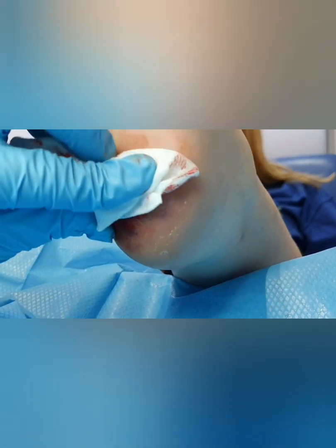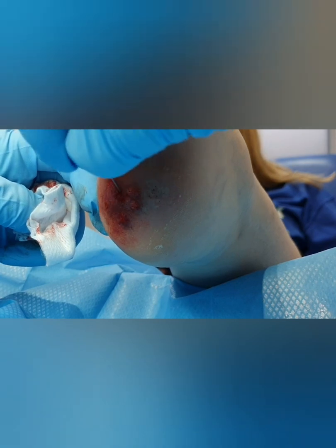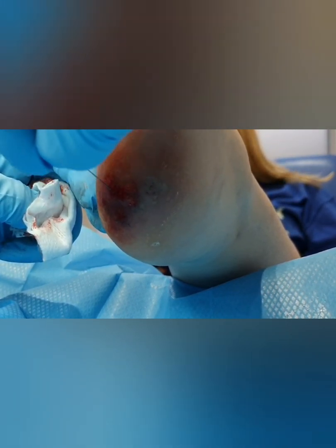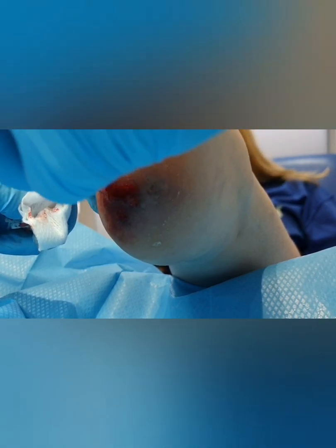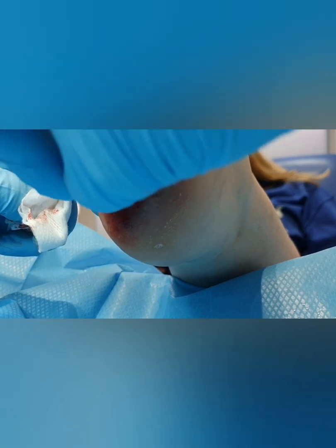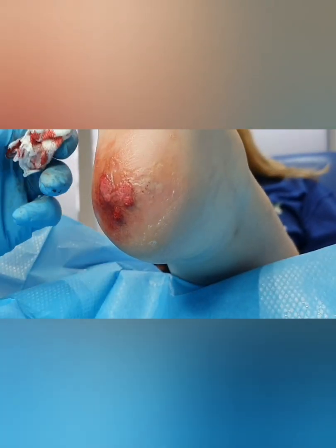Now, there is a little bit of bleeding, of course, but people expect that there's going to be lots and lots of bleeding. You can see that just isn't the case, because each of these little puncture wounds are tiny little holes. They do coagulate very quickly, so actually bleeding isn't really an issue, and you'll see towards the end, it does stop bleeding very, very quickly. So it's not as gory as people imagine.